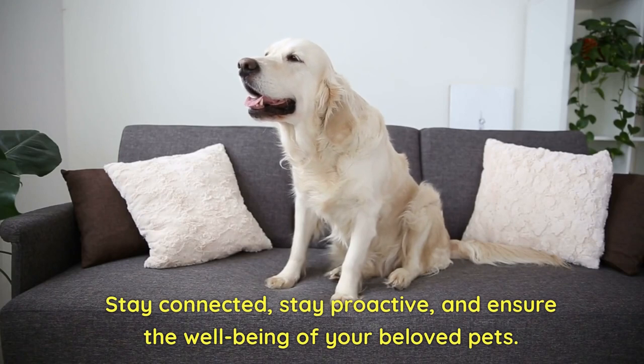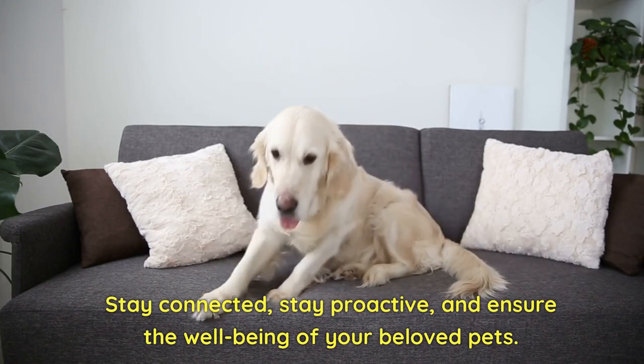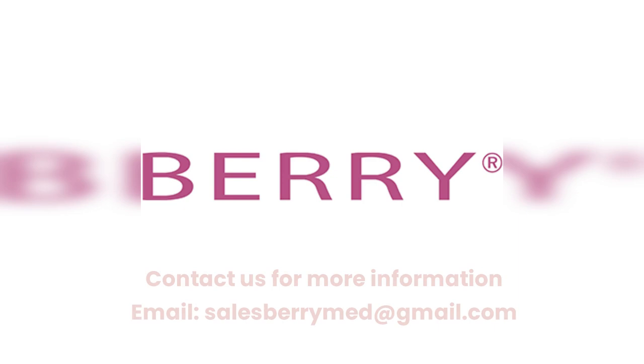Stay connected, stay proactive, and ensure the well-being of your beloved pets. Contact us for more information — email salesberrymed@gmail.com.